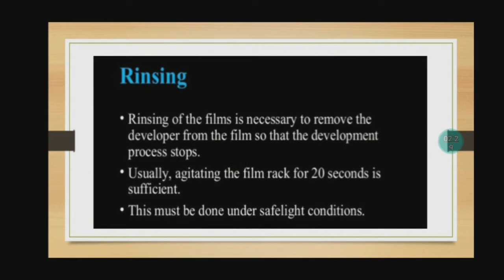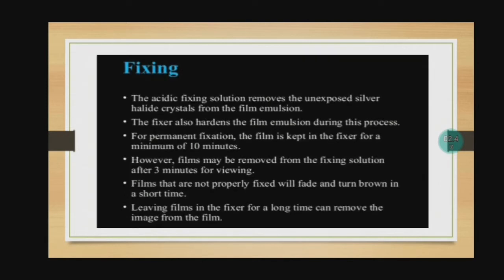Rinsing. Rinsing of the films is necessary to remove the developer from the film so that the development process stops. Usually, agitating the film rack for 20 seconds is sufficient. This must be done under safe light conditions.